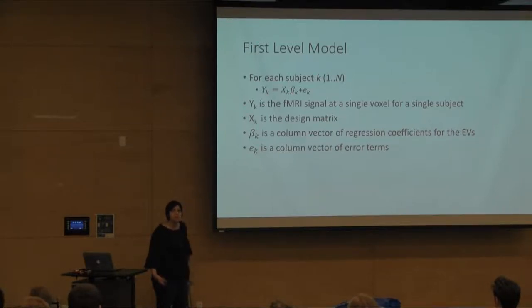And if you use FSL, you're probably not interested in those coefficients themselves, but you are interested in the significance of those coefficients. So you are modeling it as some design matrix and the weights of each of those things, and then some error, right? And this is described here.